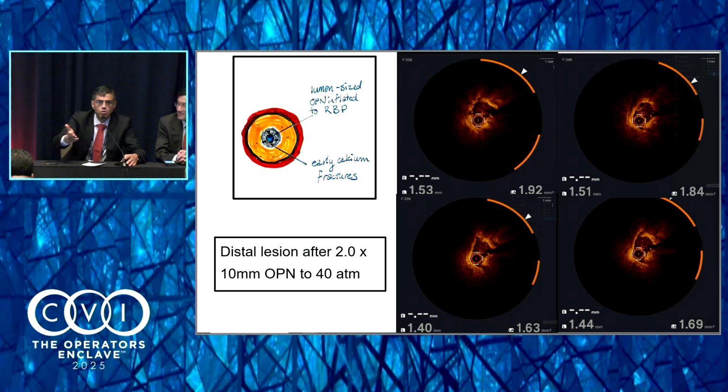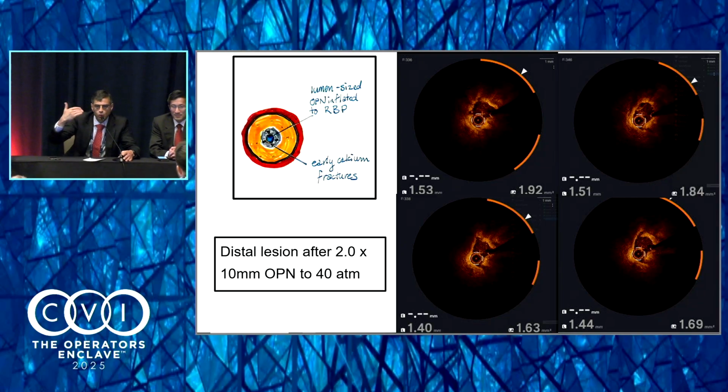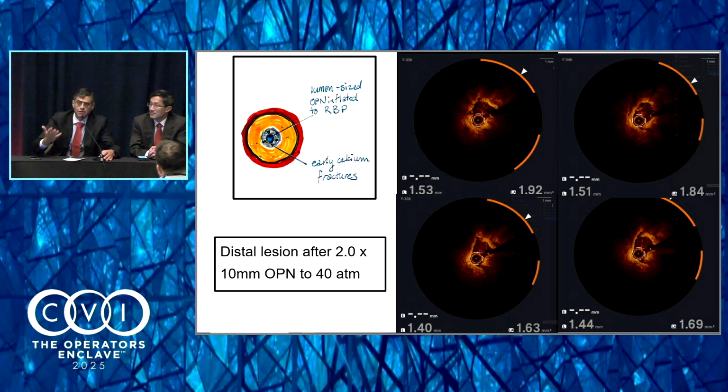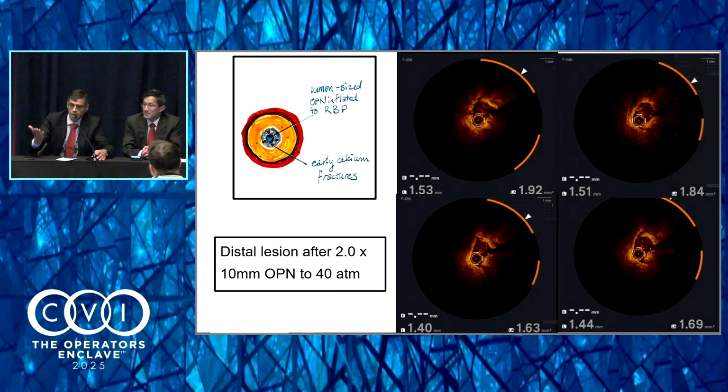So this is something that you can do quite often, both with OCT and with IVUS. It doesn't cost you anything, yes, it's an extra run, but then you can see on the bottom right, there is essentially discontinuity, right? It was around calcium, now it's not. So there's all these cracks in the calcium. The more you do it, the more you're appreciative. When you see those cracks, then the chance of expansion is very, very high. So great thing to do, doesn't take too much time.